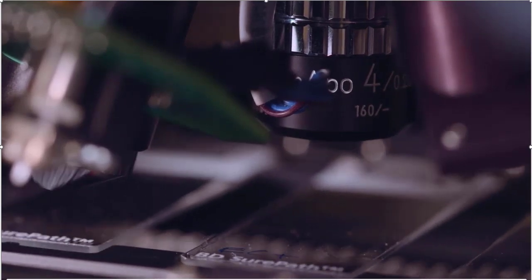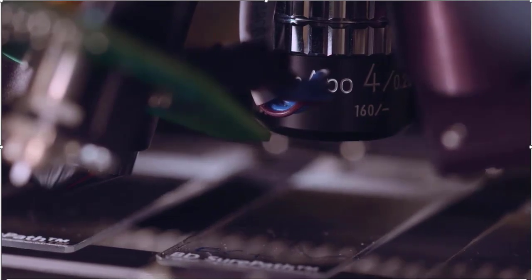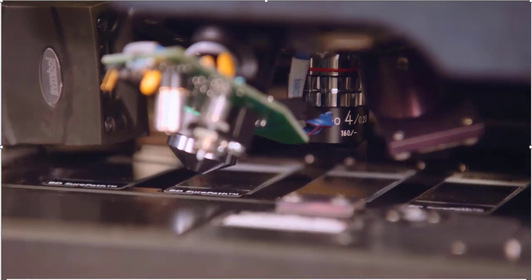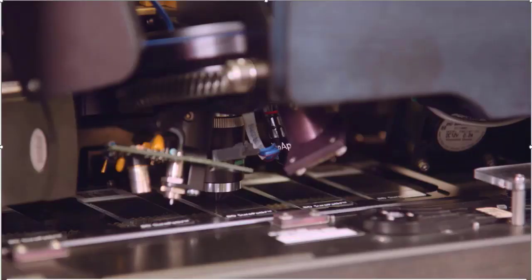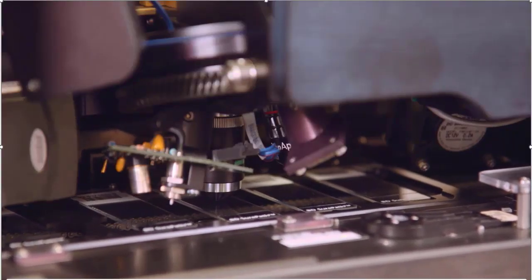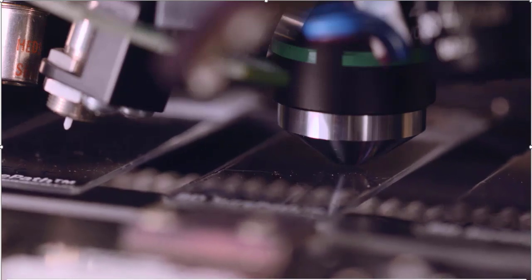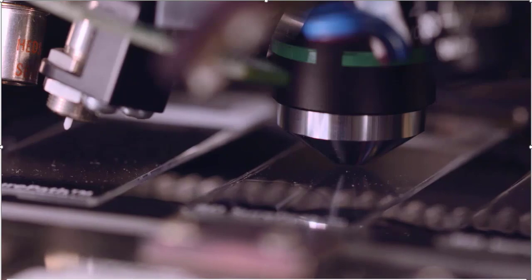The slides are first scanned at a low power 4x magnification. Group and object analysis is then used to identify the 1,000 most significant fields of interest to evaluate more closely. The system then switches to a high-power 20x magnification, where it captures and analyzes images of the slide locations selected for closer evaluation, using digital cameras and high-speed image processors.